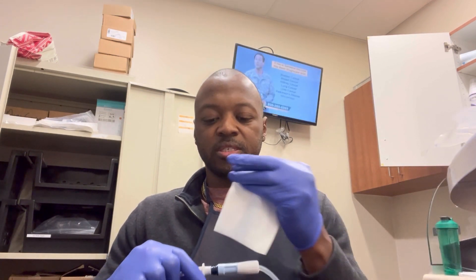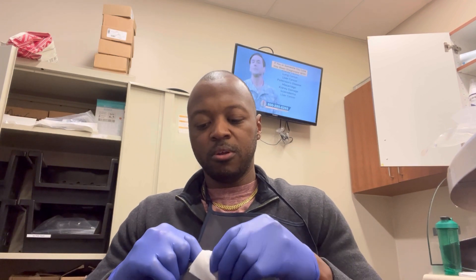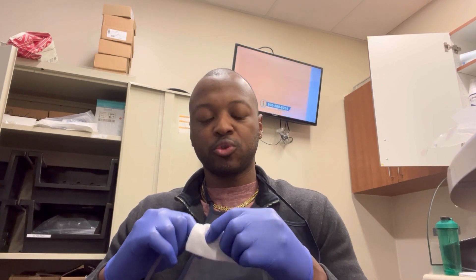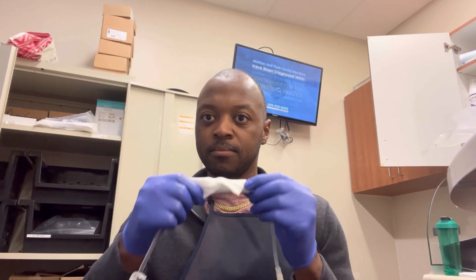I have my gauze soaked with Alcovis. I'm going to do the one-minute scrub, making sure I don't disconnect from the machine. Then I'm going to do the one-minute soak — put it down on my lap and let it soak for a minute. I'm going to get my mask ready.